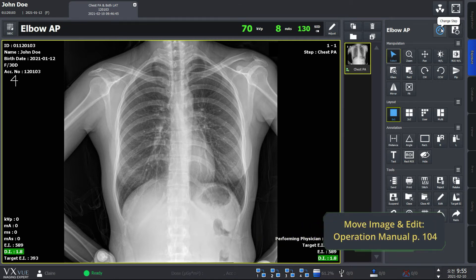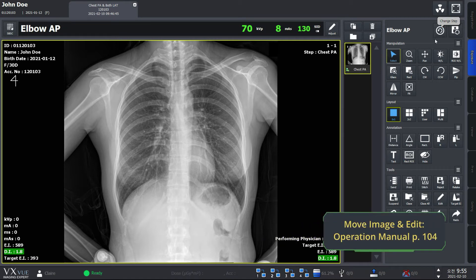For your information, you can also use Move Image or Edit function to move an image to another step or to change the step information.